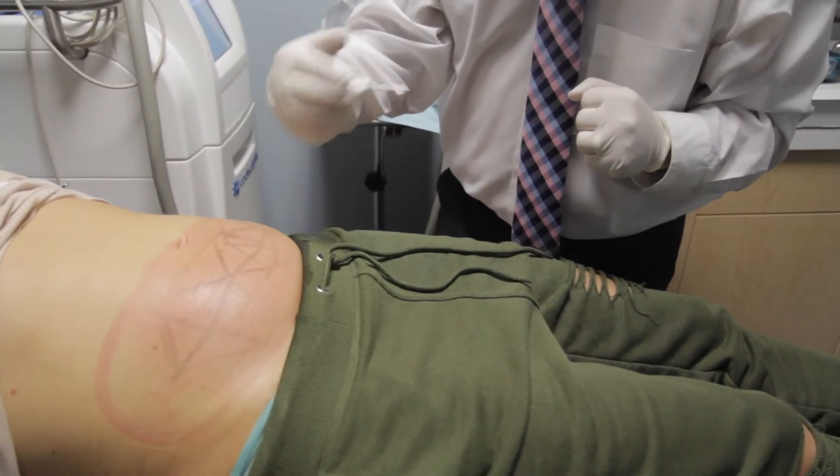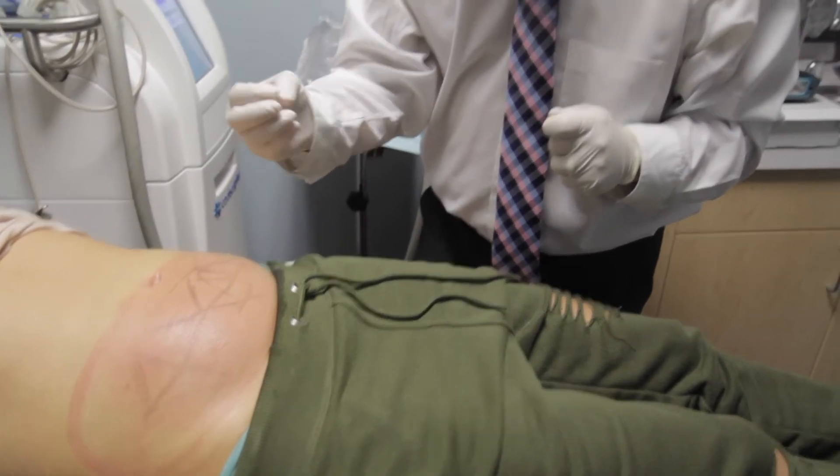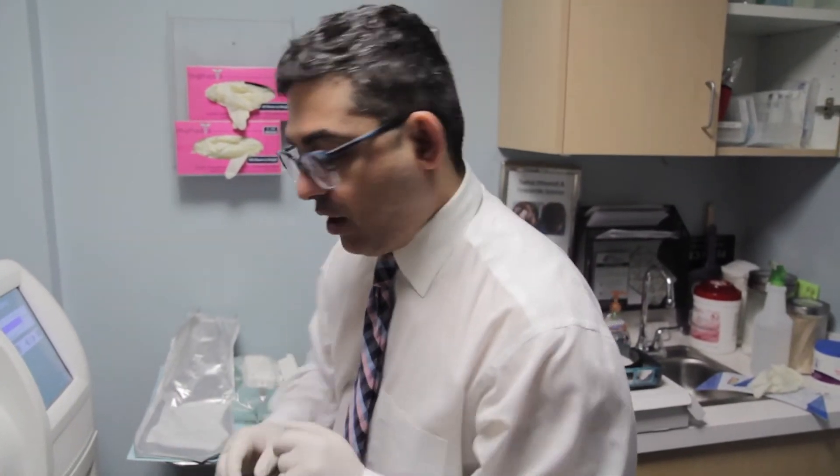Once the fat freezes, over the next three months that fat gets dissolved and is excreted out of your body. Now I'm going to demonstrate how to apply the CoolSculpting suction device onto the skin.